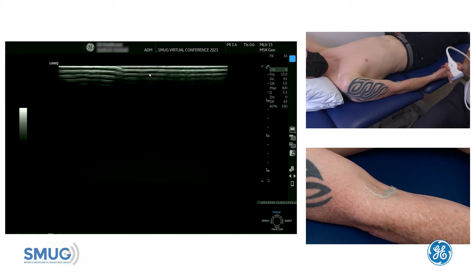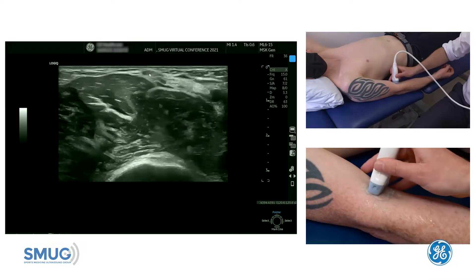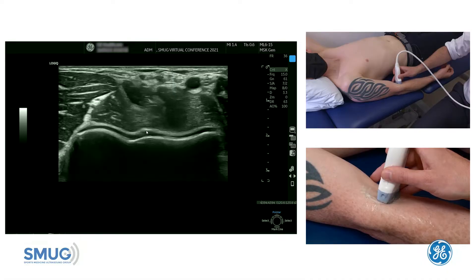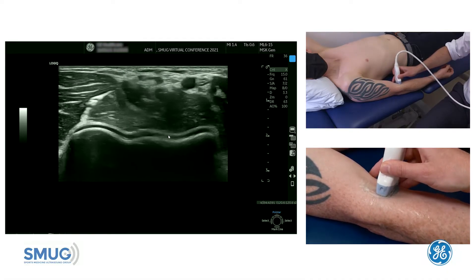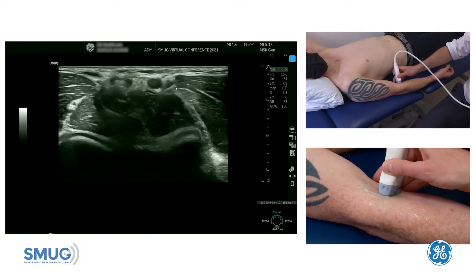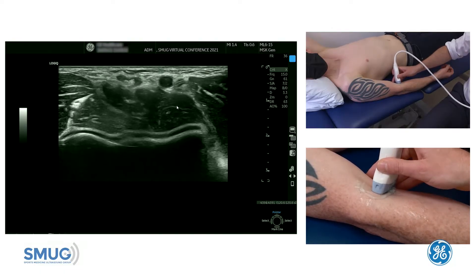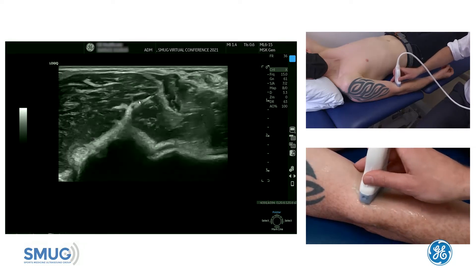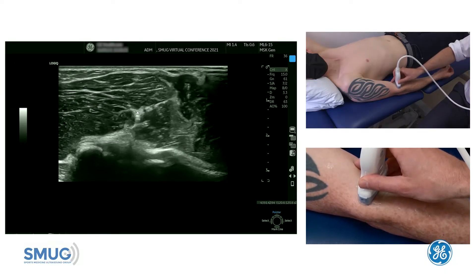Now we're going to have a look at the posterior interosseous nerve and we're going to find the radial nerve first by going to the anterior elbow. We can see the biceps tendon at the top and as we come down we get a really nice transverse view of the elbow joint with the articular cartilage. If we move medially, you can see the median nerve which sits in the fascial plane between pronator teres and brachialis. If we move more radially, in that fascial plane, we can see the radial nerve.